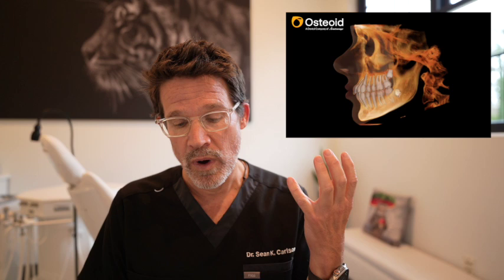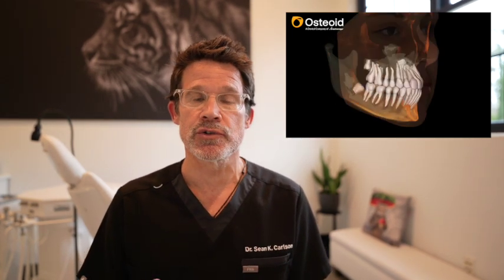This is such an important tool when it comes to patient communication, and also when it comes to inter-colleague communication. So like I said, we've been using these digital models for so long now, it just seems like that's just the natural way of talking about 3D images. And we share these with our referring doctors to describe how we're going to do orthodontic treatment. And one place where it's really come in handy and it's incredibly beneficial is when we order specific surgical procedures from our oral and maxillofacial surgeons.